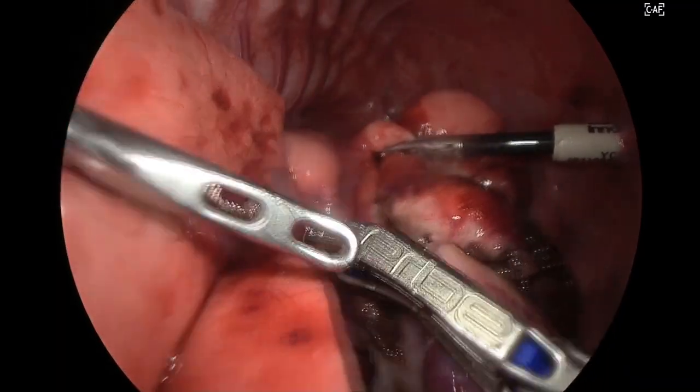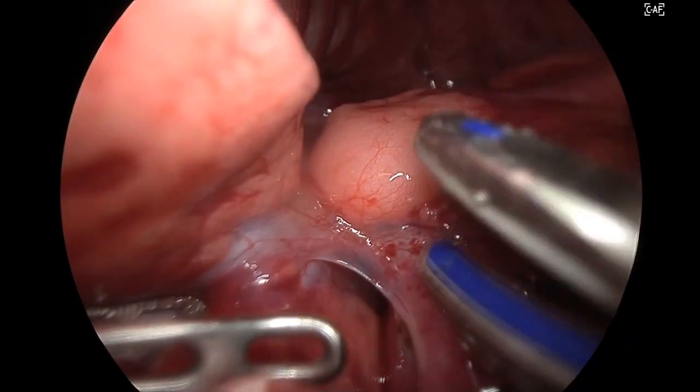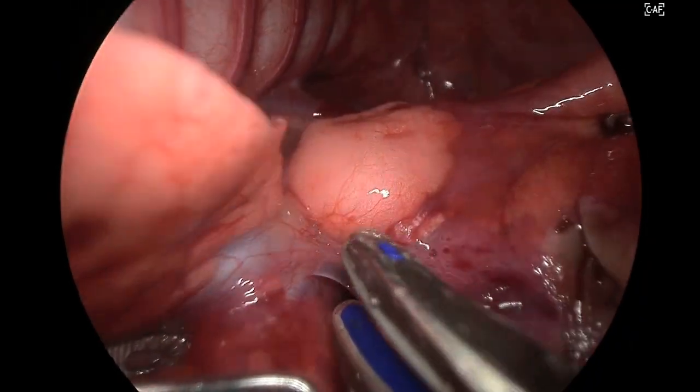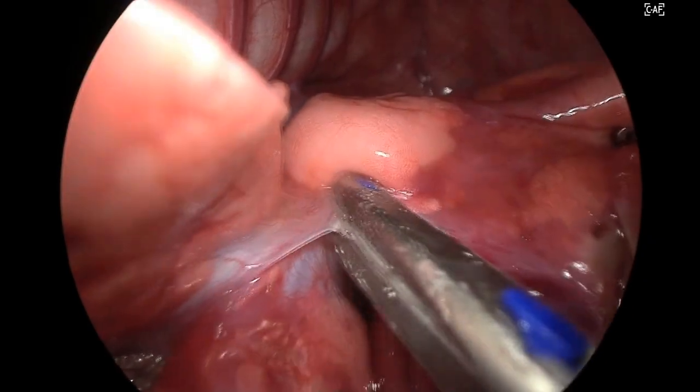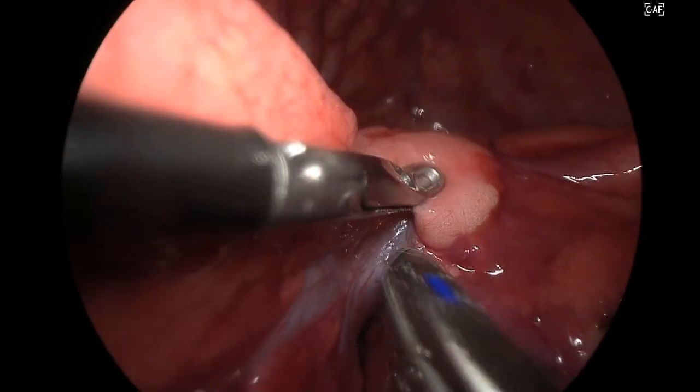So we are just at the apex of the fissure. The approach in thoracoscopy is usually to go to the bronchus first in these cases. So we're just creating a space here, and we can see there are some vessels here.